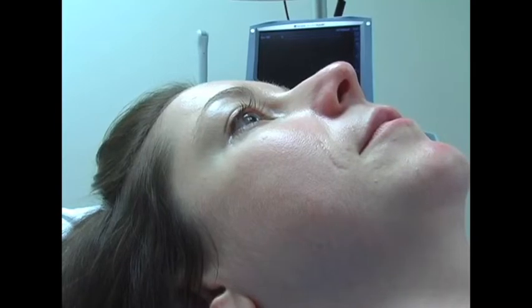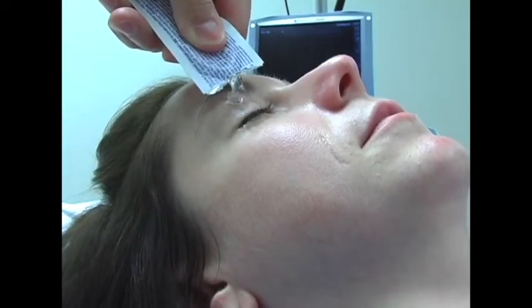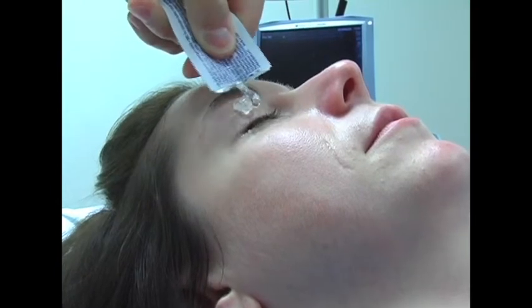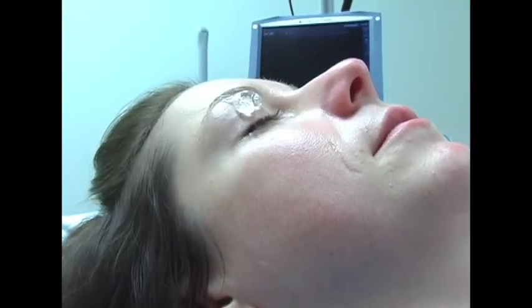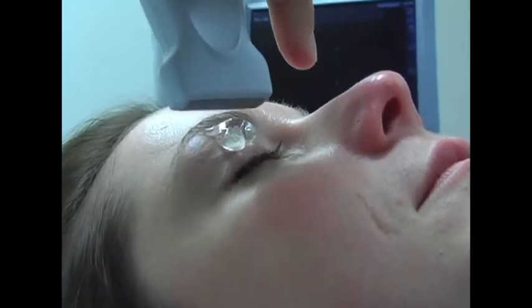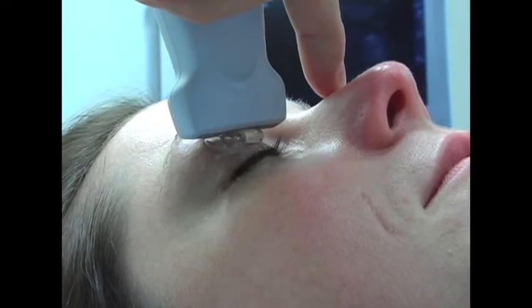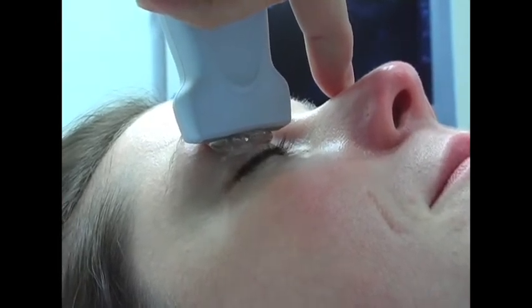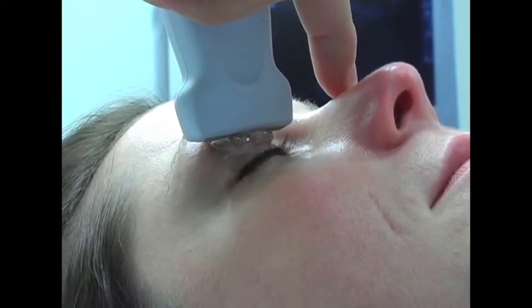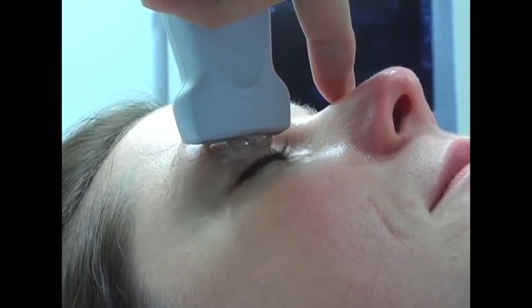First, apply sterile gel to the closed eyelid of the eye of interest. Then, using a linear high-frequency transducer, place it on the patient's eye with the probe indicator pointing to the patient's right. Make sure that you anchor one of your fingers on the bridge of the nose or frontal region so as to not apply too much pressure to the globe.